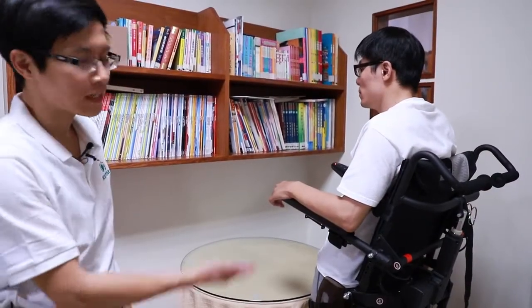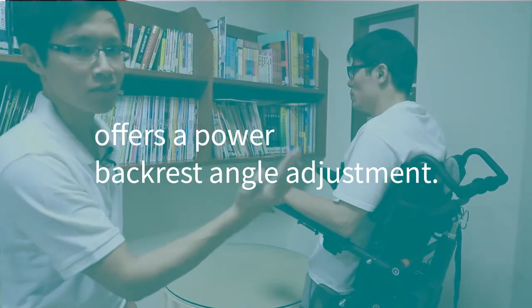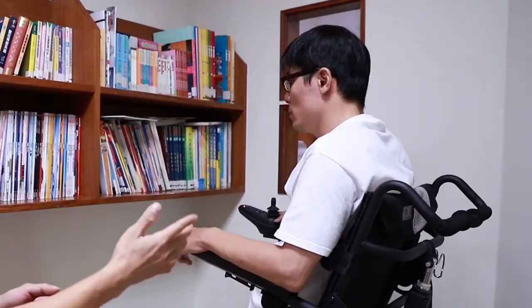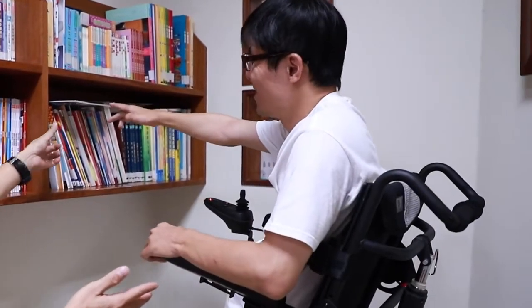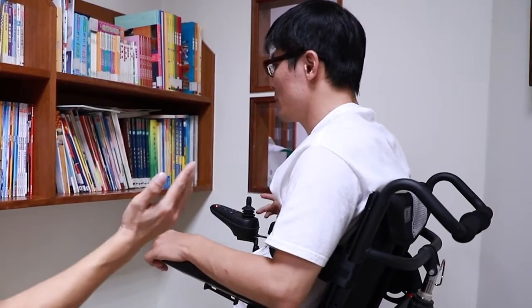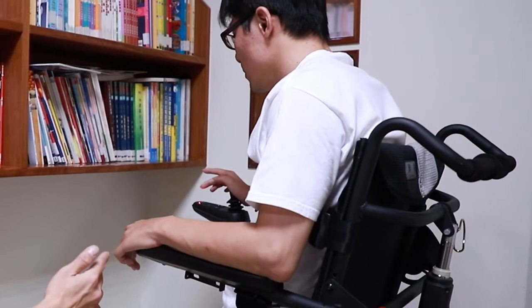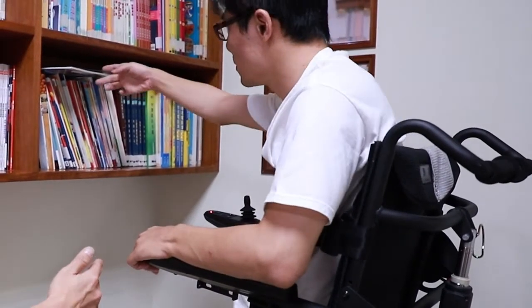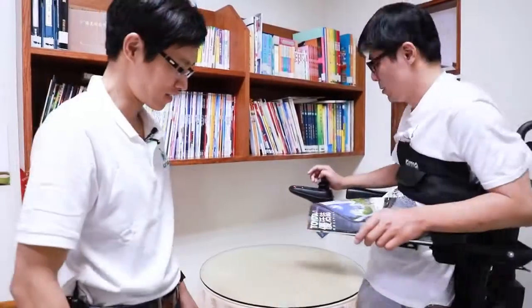Besides the standing up function, Karma Ergo Stand also offers a power backrest angle adjustment. The user can open up the seat to back angle when he needs to rest on the chair. But more importantly, the angle can be adjusted anteriorly. The anterior seat to back angle can give the user extra support when he needs to lean forward and grab something from the shelf.